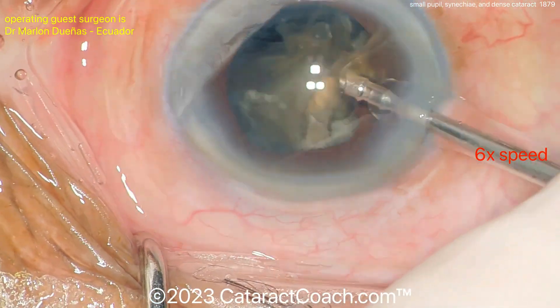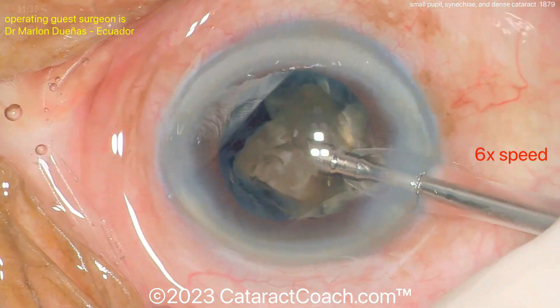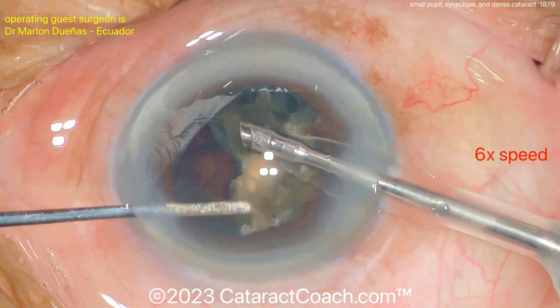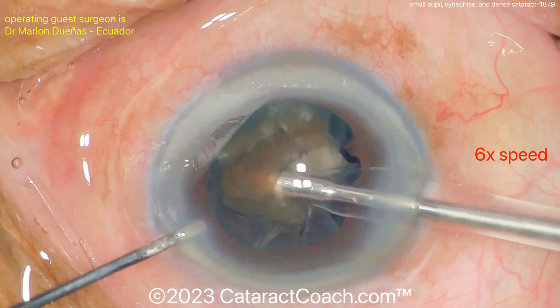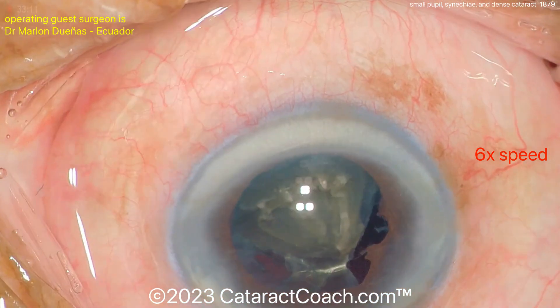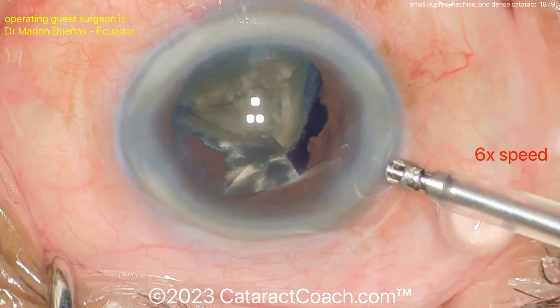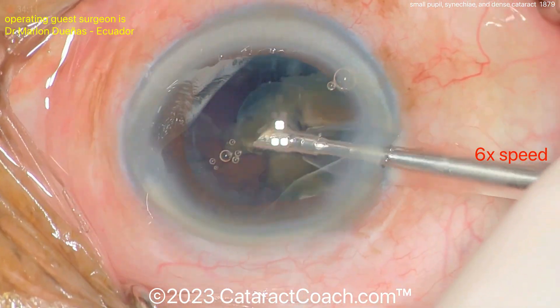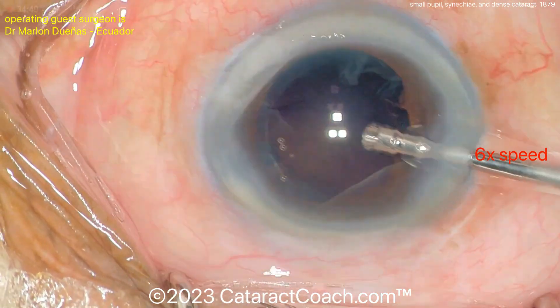Taking your time to chop up the remaining pieces. With the last piece, get the chopper in what I call the safe position — smooth end of the chopper underneath the lens material — so that if the capsule comes up, you have a margin of safety. Aspirate, aspirate, aspirate — that looks great. Then more viscoelastic: essentially four coats of viscoelastic, very cautious and gentle to the cornea and posterior capsule.